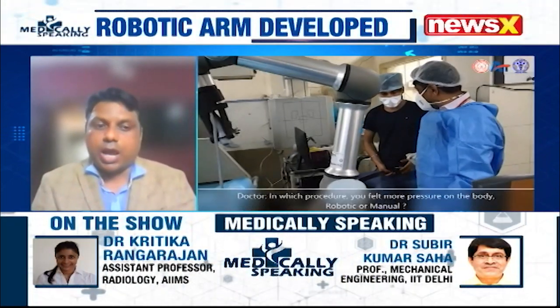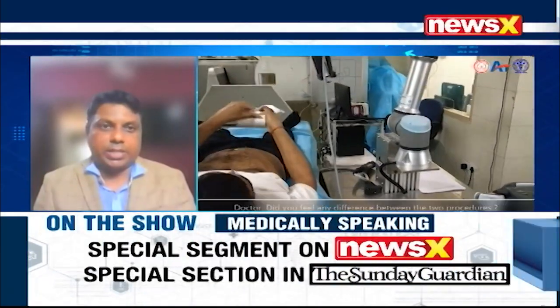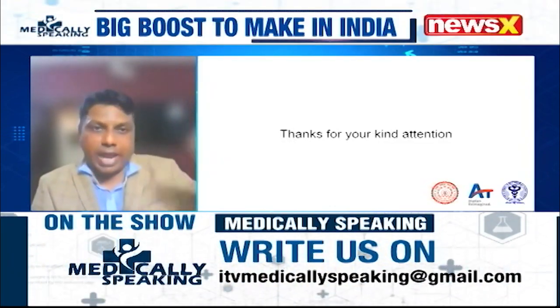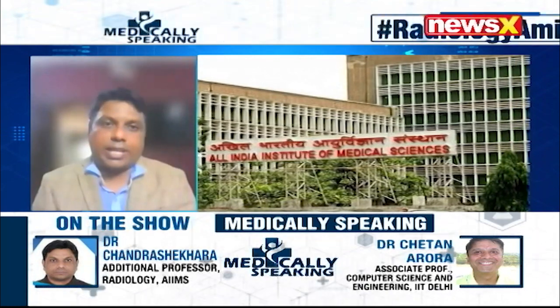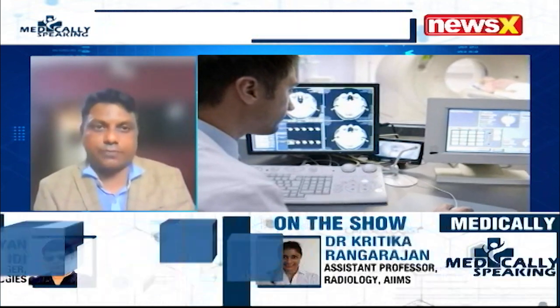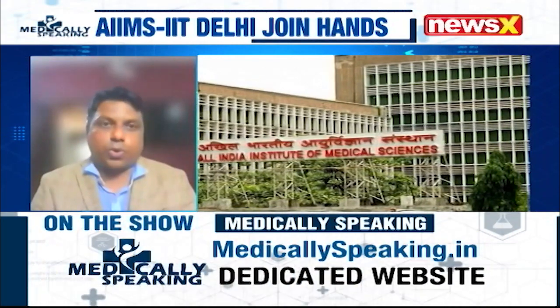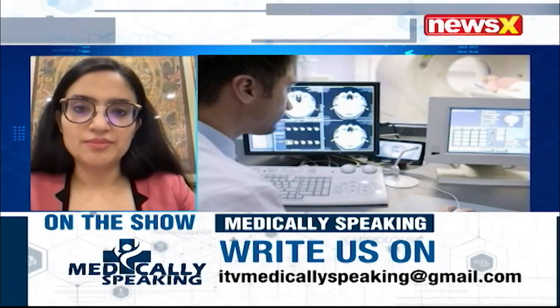Then we approached IIT Delhi to explore the possibility of a robotic system that could help us conduct this ultrasound remotely. So the radiologist will be sitting quite distant from the patient, and we will control the robotic arm, which is placed just next to the patient, and the probe will be connected to the robotic arm, and the images will be transferred live through Wi-Fi, so that we can interpret at the same time. The advantage being the lesser the human contact, the lesser the chance of cross infection. And we'll be saving lots of PPE kits as well. And if we extrapolate the same concept elsewhere, we can also do tele-robotic ultrasound quite distantly.